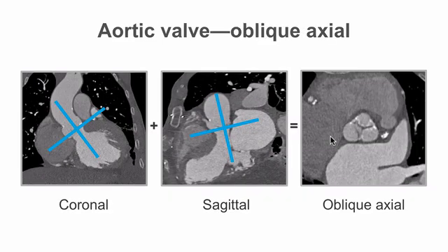By making these two simple movements, the aortic valve is revealed. In this image we can see that the aortic valve has three cusps, and there is some evidence of calcification at the cuspal margins.